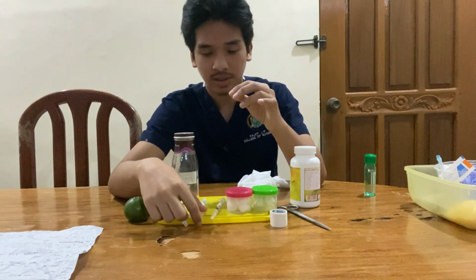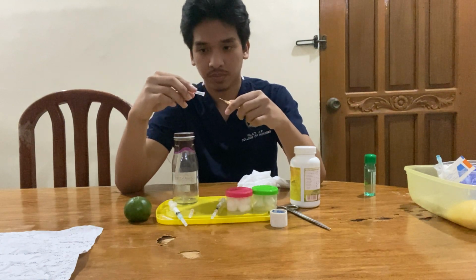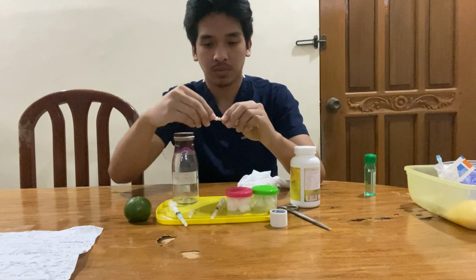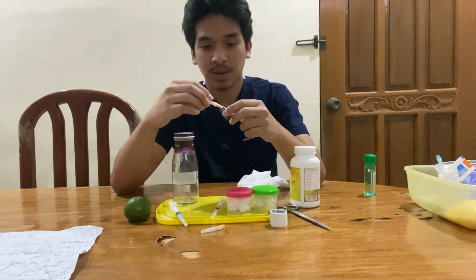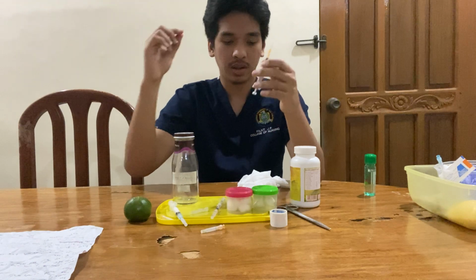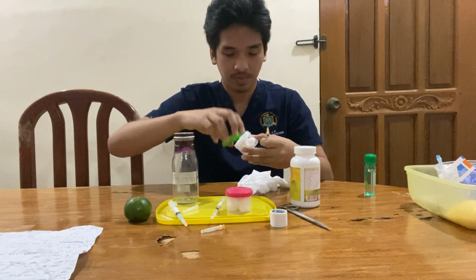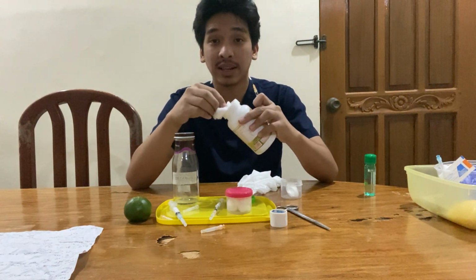Next is the insulin. We'll do the same thing. Okay, and then we will first clean. Since it's open, we'll clean it.